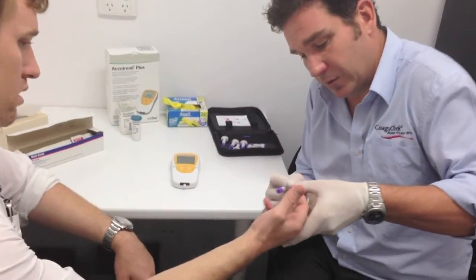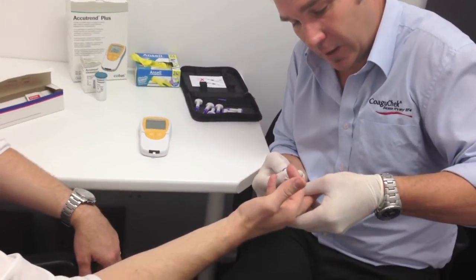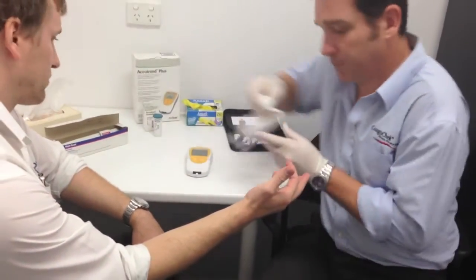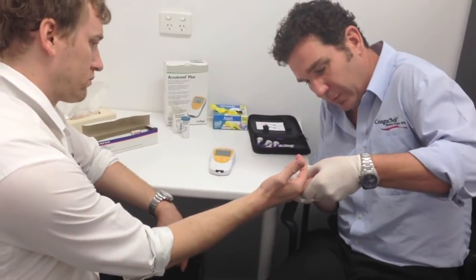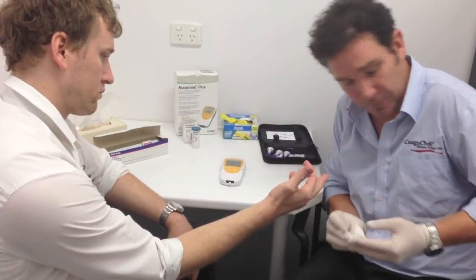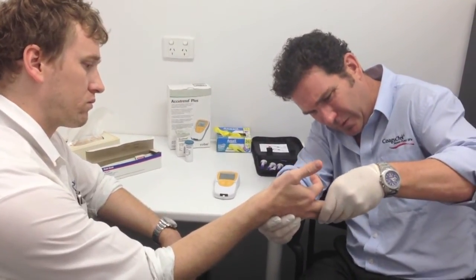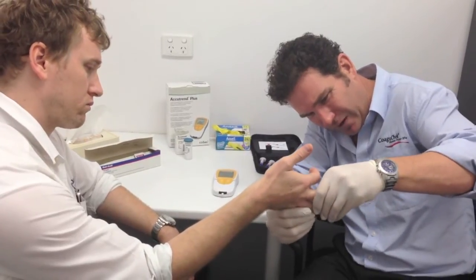So we're going to take just on the side of the finger — and that's it. Grab a tissue and wipe that first drop of blood away. Now we just work that finger and we get a nice fat drop of blood.